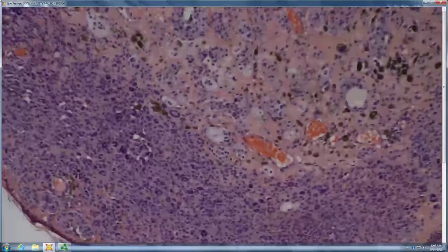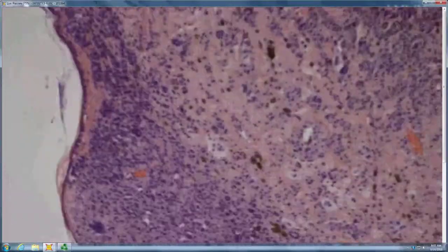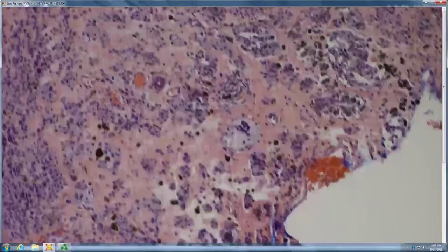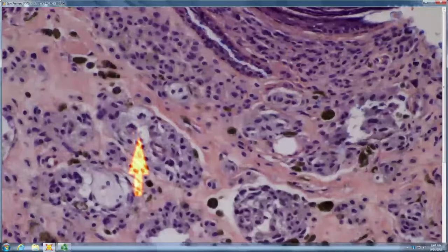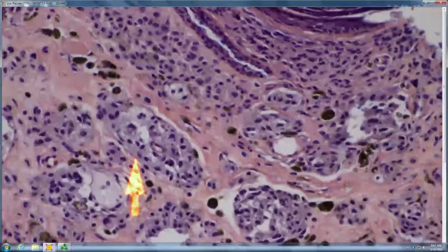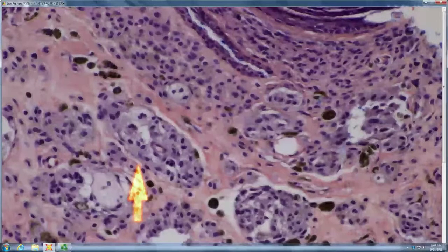Also got a melanocytic proliferation. There's a lot of pigment that's kind of deep. So you have clearly two populations of cells, right? You have this population out here, and then you have this population that has ample dusty gray cytoplasm, small hyperchromatic nuclei, inconspicuous nucleoli, smudged chromatin pattern.